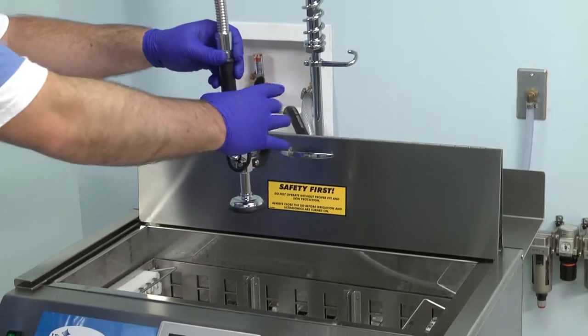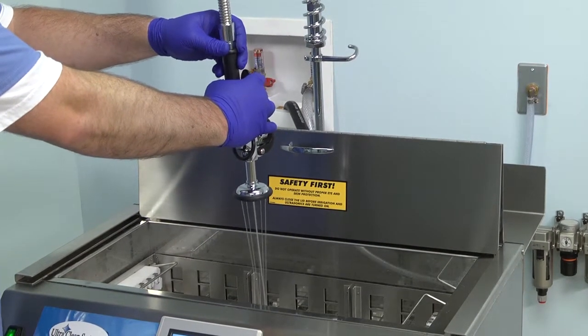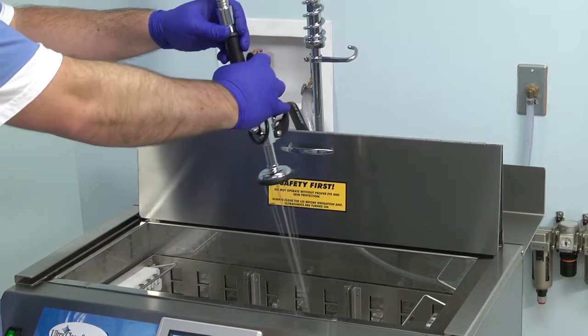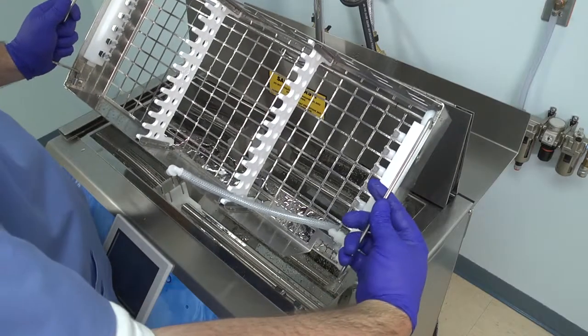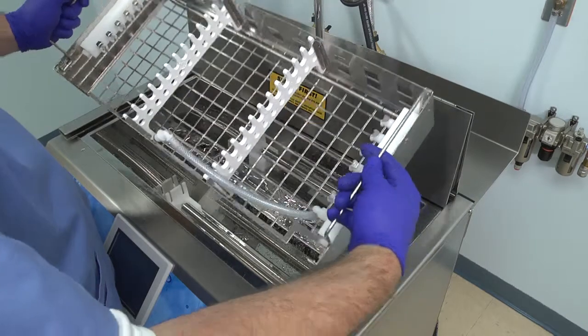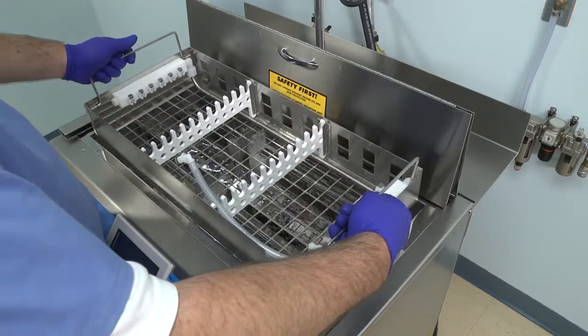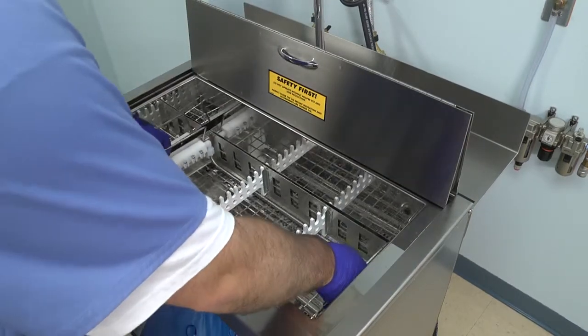For details on how to properly load instruments into the baskets, refer to the basket loading video. Once the trays are loaded, insert the bottom tray with the port cutout on the right side as you are facing the machine. This tray should sit flat with nothing touching the rod on the bottom.